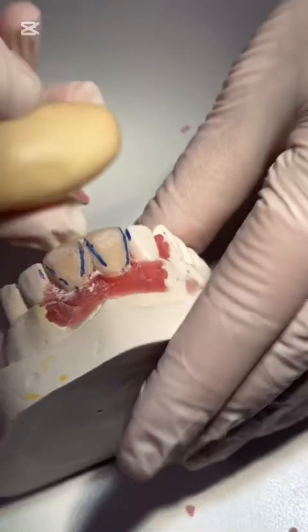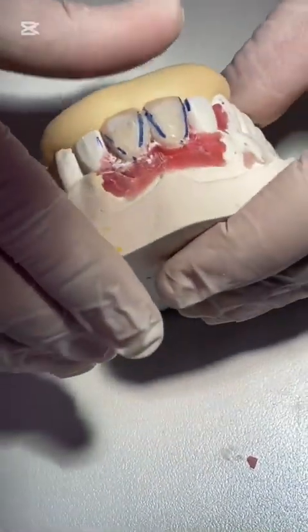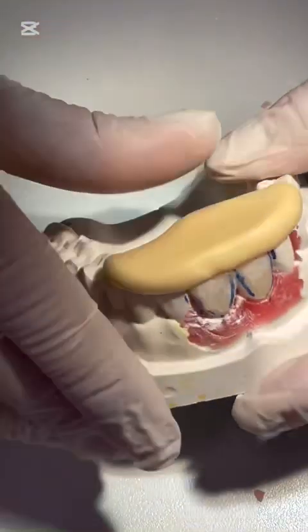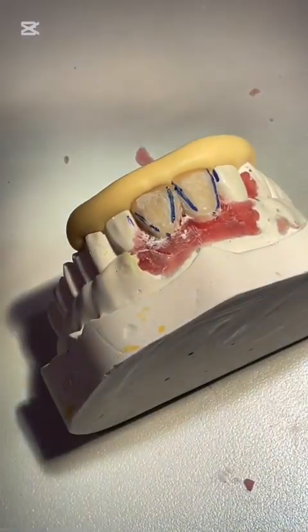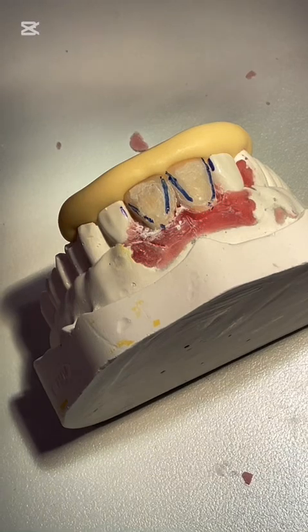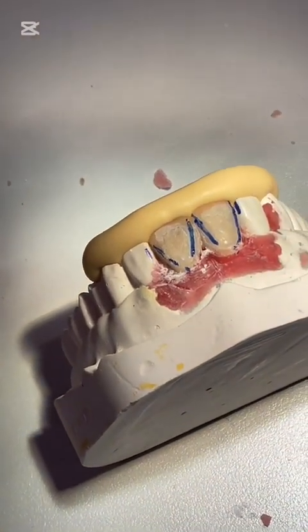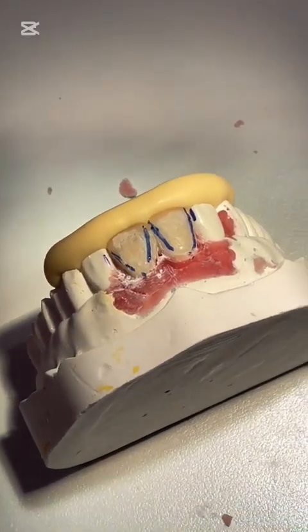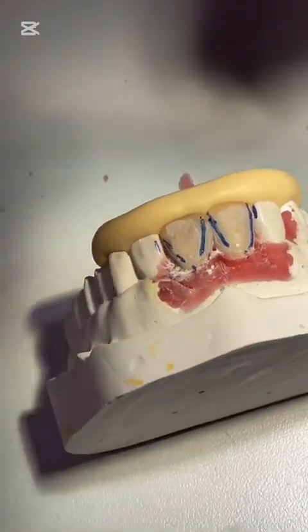Then I will take the impression. Okay? This is what you see on Instagram, right? We will wait for the material for the setting. We have to wait.